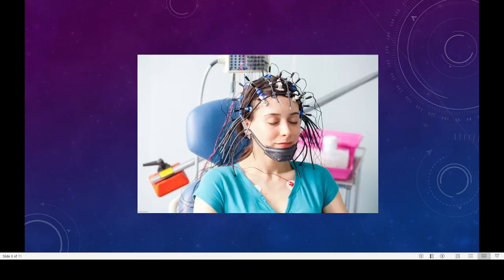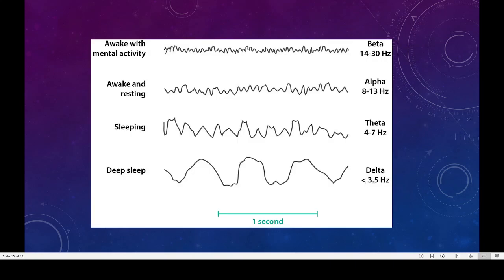So these kinds of techniques are basically employed in the use of EEG. Here you can find the technique used for EEG. These are all small, fine electrodes placed on different parts of your head. Then you can see that in the use of EEG, there are different types of waves which we have already seen. Normally, delta waves are produced during deep sleep, and theta waves are produced by your brain during the time when you are sleeping.